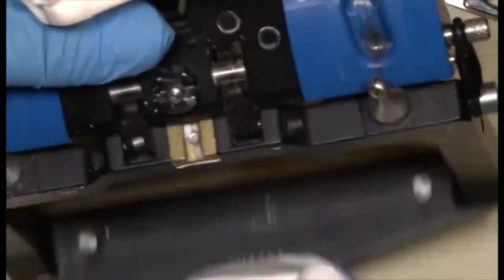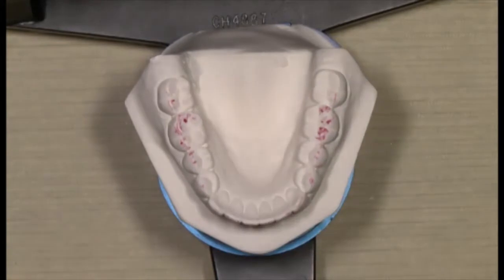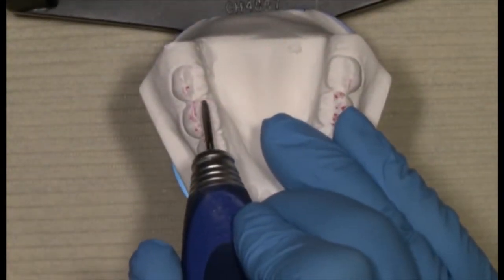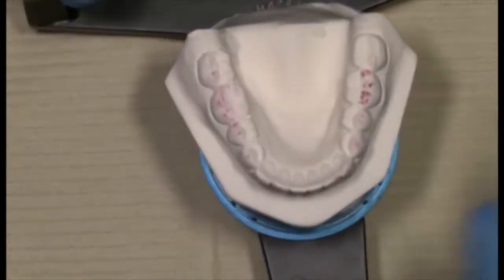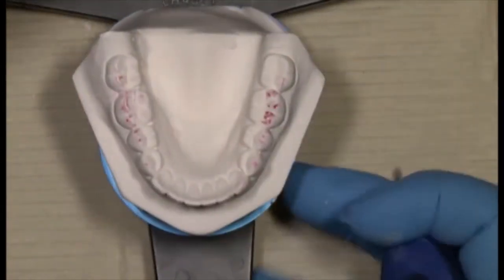And then you would look at the bottom. This is on an incline. The fossa is more in the center. So anything on the sides, that goes away, okay? And so if you start to work through this, you'll see clearly what you're trying to do.